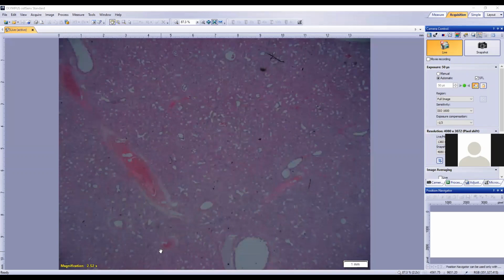Type 1 pneumocyte damage, yep, so that's part of the pathophysiology. So what can damage type 1 pneumocytes? A lot of things. Yeah, viral, lots of things, yep. Viral, yes. Bacterial. Yep. So check out some specific viruses. Herpes virus. Herpes, yes. I'm more into cows and sheep, sorry. But no, absolutely, yeah. And this is one of the important things. As a side note, doing lots of cows and sheep will stand you in really good stead in terms of descriptive stuff for boards and in general, because yeah, the path is so interesting.